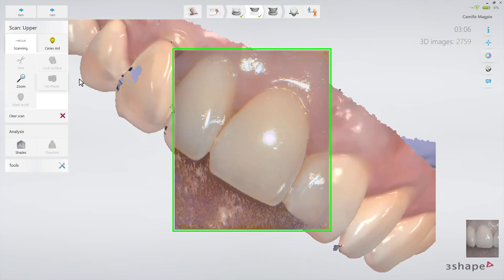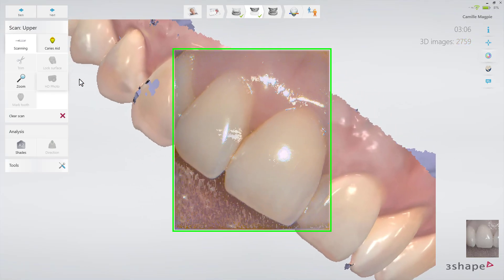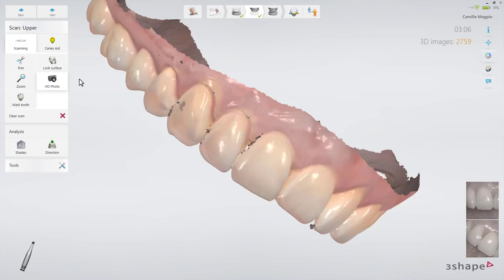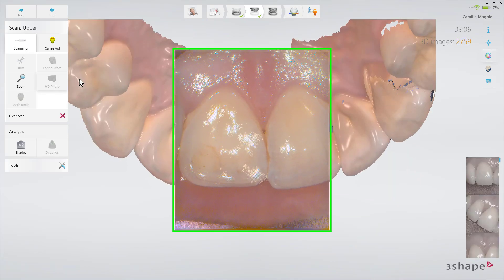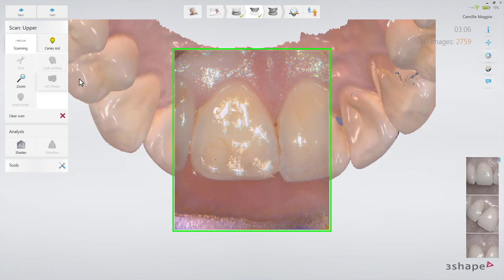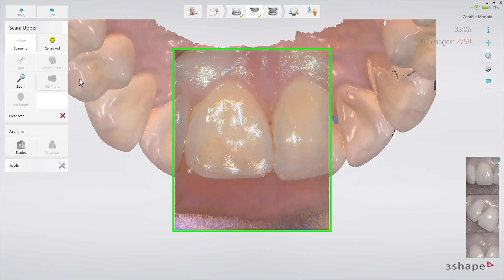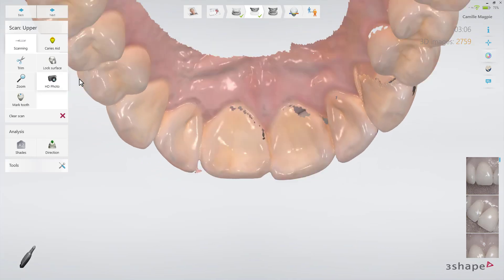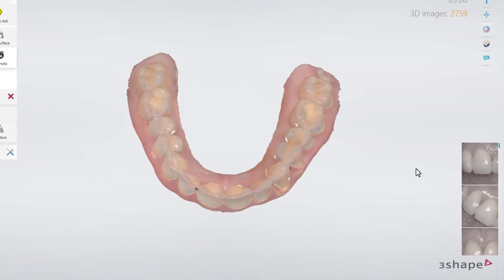You can add several HD Photos to the scanned model to supply the lab with a visual appearance, giving the possibility of documenting cracks, marks, or stains on the prepared tooth and the neighboring teeth. HD Photos can also be a big help during placing the margin line.